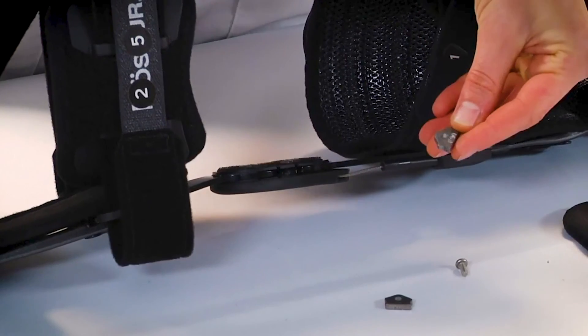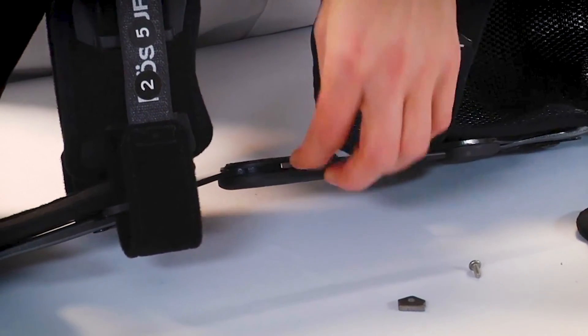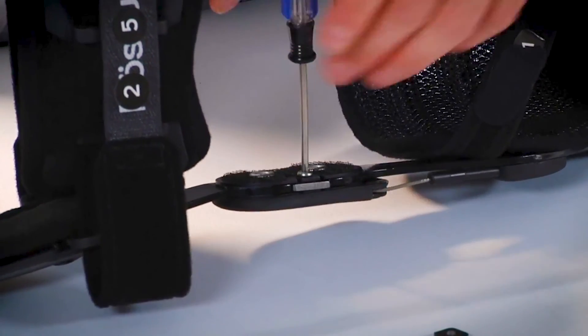Insert the desired extension and/or flexion stops. Secure the stops with retaining screws and replace the condyle pads on the hinges. Do not over-tighten the retaining screw.